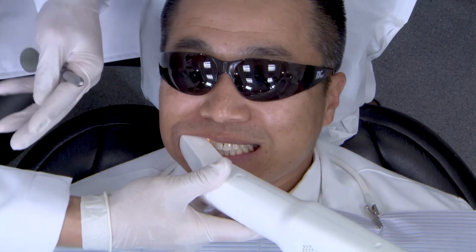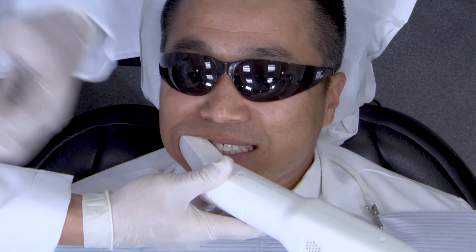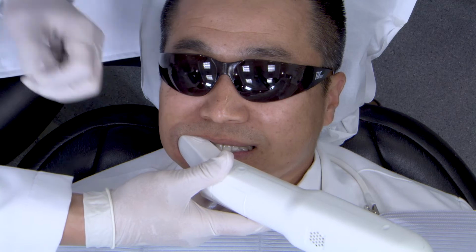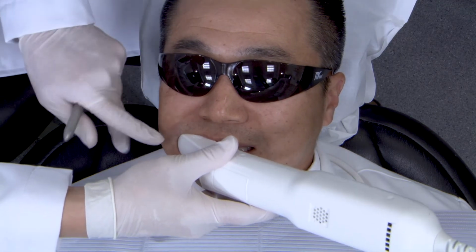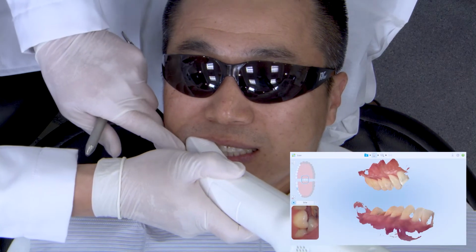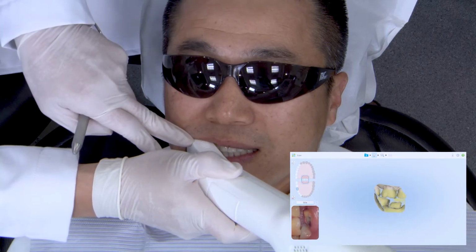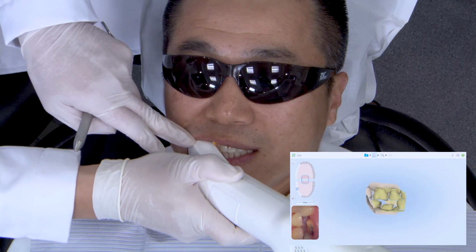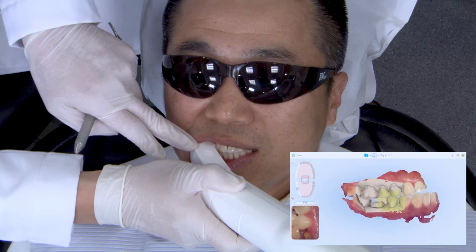So we ask the patient to bite down and just kind of clench together, and that allows the PDL to compress. It really ensures that we have the teeth in the most centric position. Once they're in that position and the camera's in position, now I'll activate the camera. The activation on the iTero is on the scanner itself. Activate the camera and begin capturing information on the buccal surfaces on both the upper and lower.